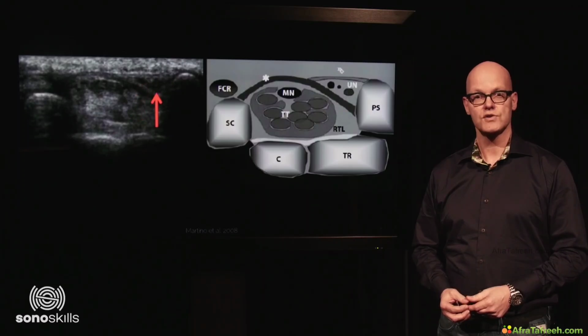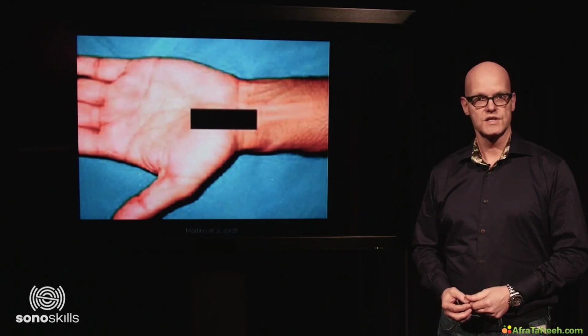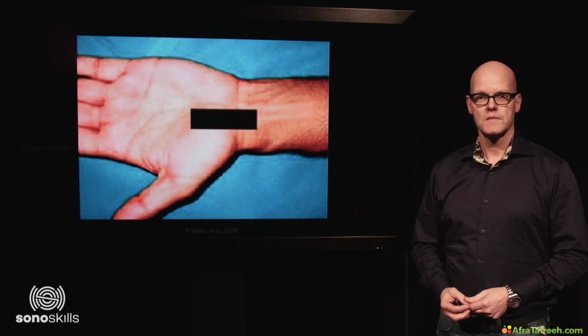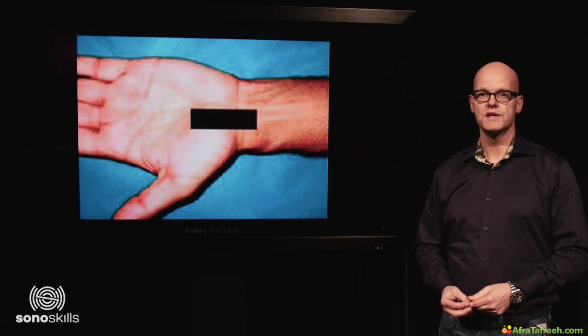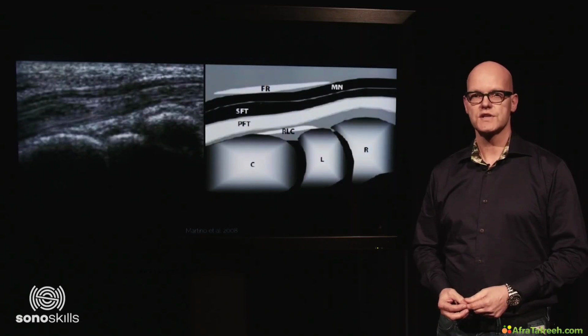and ulnar nerve. To scan the proximal and distal carpal tunnel longitudinally in long axis, place the transducer in the length of the tunnel on top of the median nerve. The osteology that can be seen are the radius, the lunate and the capitate bone.